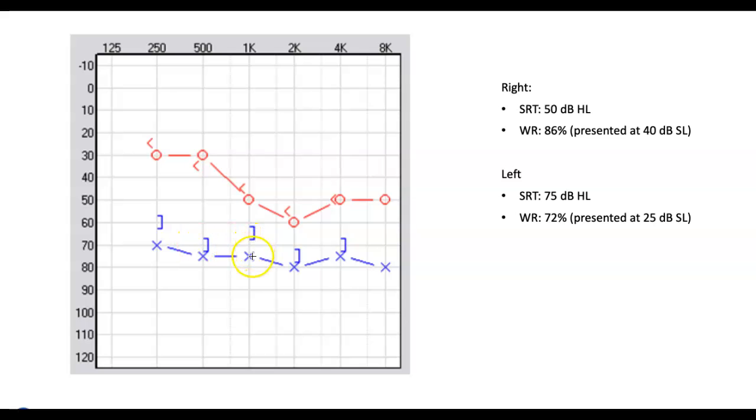So if you look, it's a 10 dB, so there are no air-bone gaps. Does everybody see no air-bone gaps? First thing. Oftentimes, we won't do masking at 250. But if it's done, it's done. There are some issues with doing it at 250. So we usually do 500, 1,000, 2,000, and 4,000.